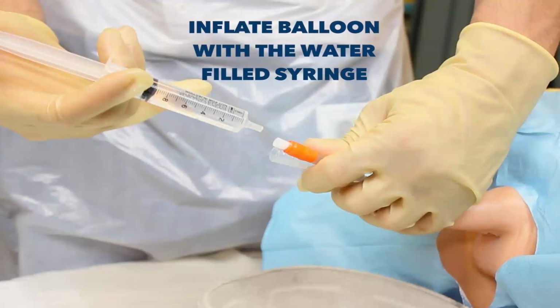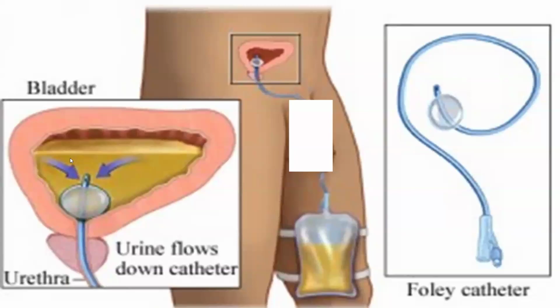Once you inflate the balloon, you will pull the catheter back again, fully and gently. Why? To make the balloon very close to the base of the bladder, not the top of the bladder.